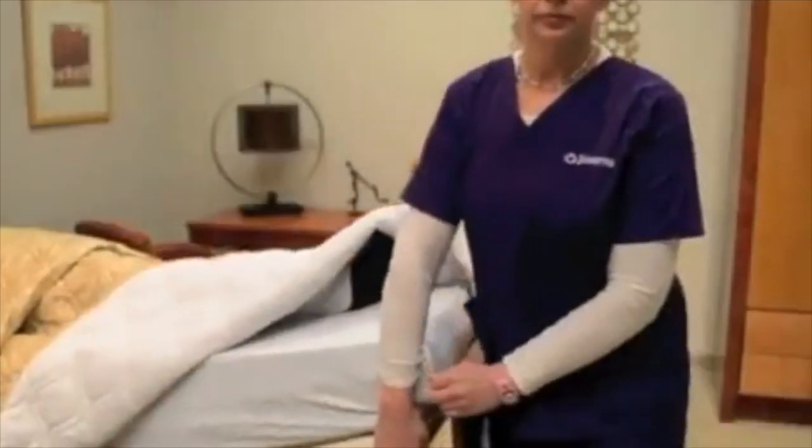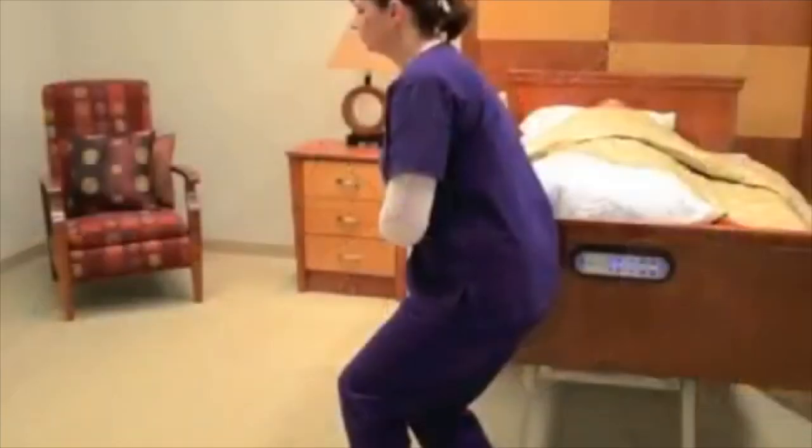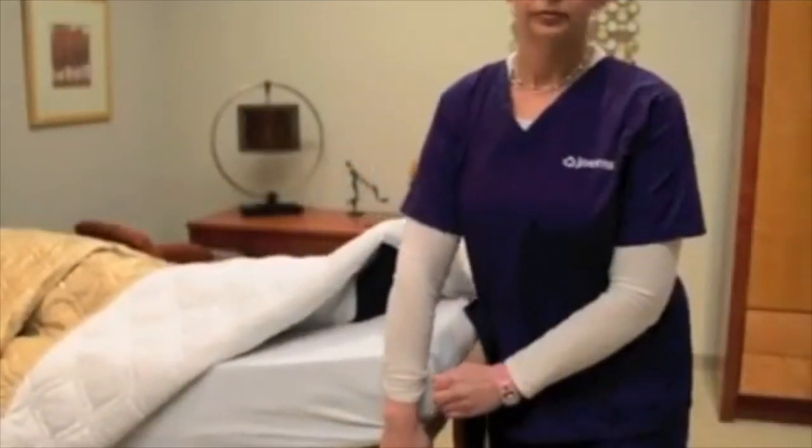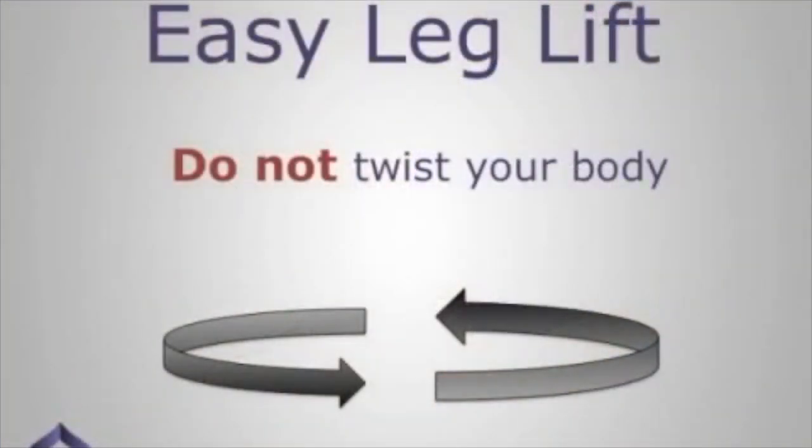Once the bed is at the right height, stand at the footboard end of the bed, place one foot about a foot in front of the other, bend both of your knees, and take a hold of the frame with your arm that is closest to the footboard. It is important that you do not twist your body. Then simply pull up on the frame. You will hear clicks as you lift.